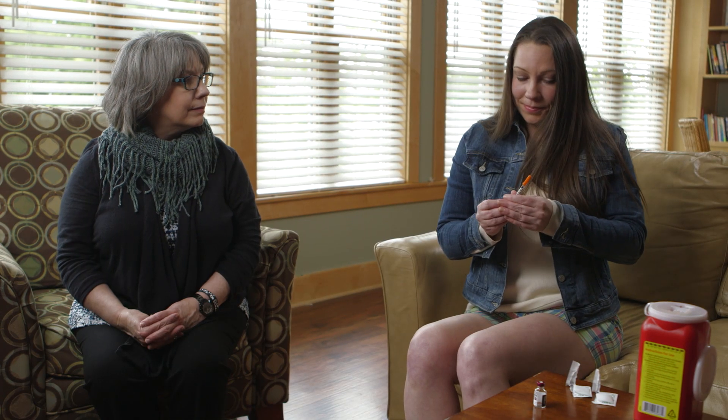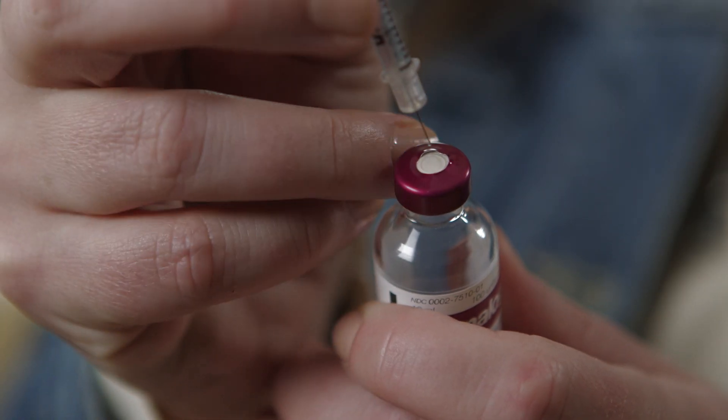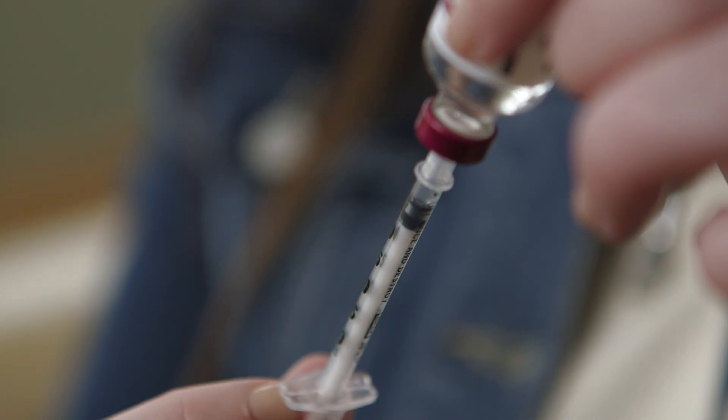Remove the needle cap by pulling it straight off the syringe, then throw the cap away. It's important to make sure the syringe has the right amount of insulin and no air bubbles.